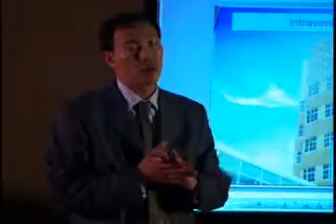Yeah, I think that it really depends on the case. I think that there are a number of situations whereby this kind of surgical planning would be very, very useful. We just submitted a paper on surgical planning for AVM surgery. And one of the conceptual ideas, for example, is the dictum that you do arteries before veins. Conceptually, it may be very difficult to plan a surgical approach based on the 2D image. And one of the things we found very, very useful has been looking at the directionality of surgical attack with particular emphasis to the arterial feeders, taking them first and then leaving the veins down, which has been very, very important.